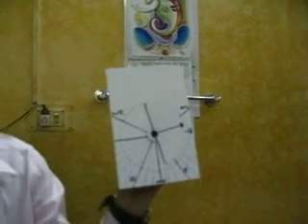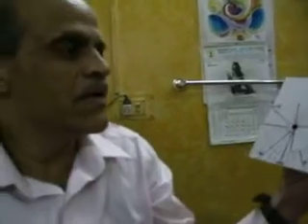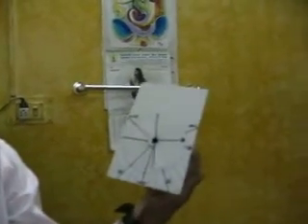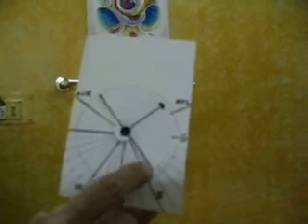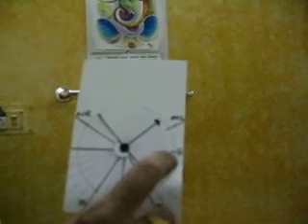If there is an ECG in which lead 1 is positive, lead AVL is positive, but lead 3, AVF and 2 are negative, then the axis is even more towards the left, because we have to now expose and only cover lead 1 and AVL, and then what you see is the direction of the axis is minus 60 degrees or even more. Alright.